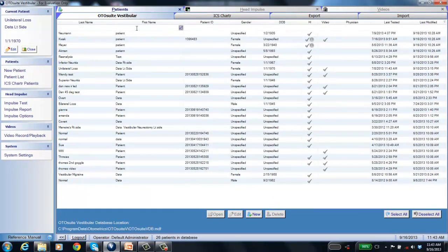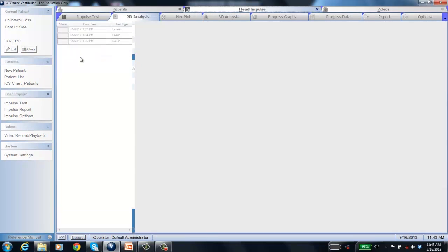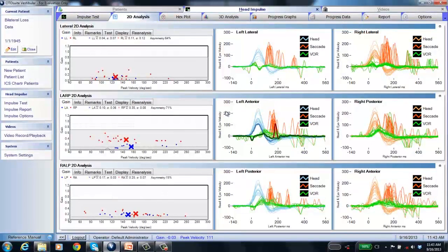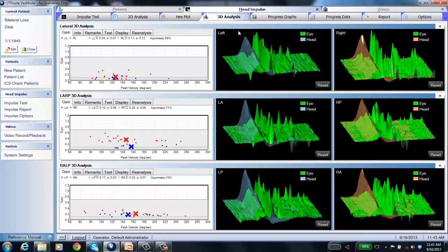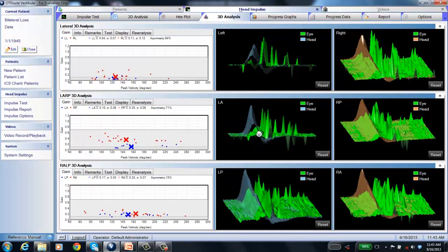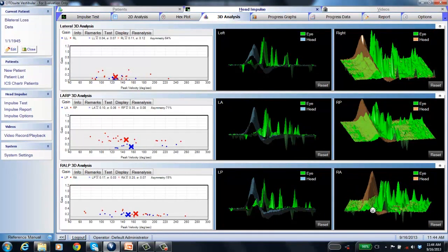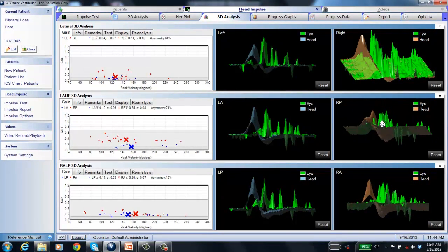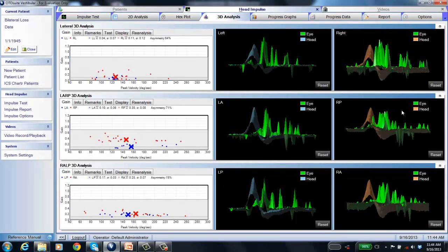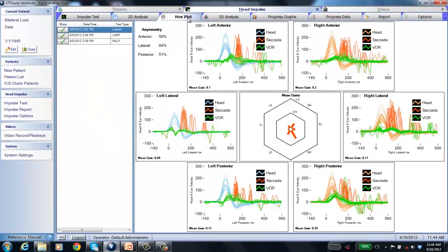Looking at a bilateral loss: catch-up saccades are present in all six canals — right and left lateral, right and left anterior, right and left posterior — and all gains are in the gray region. In 3D, the canyon Dr. Hamagi describes is visible in all six canal traces. In the hex plot, everything is orange and small — that's abnormal.